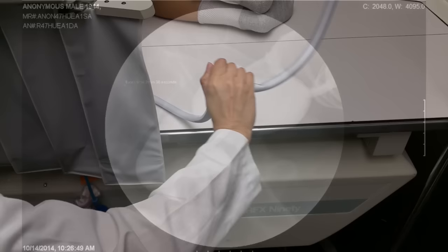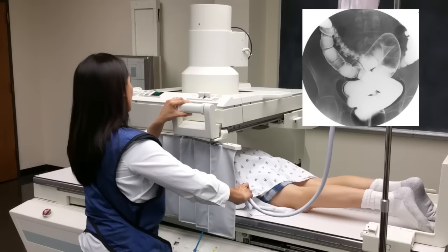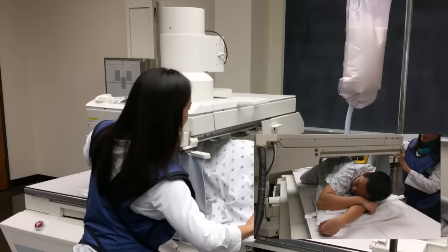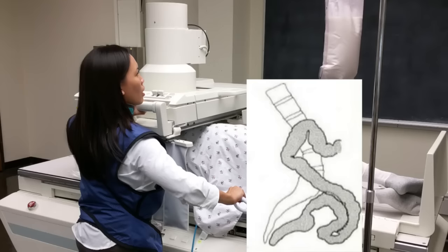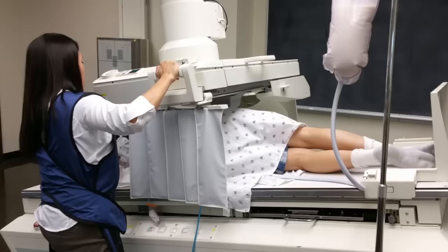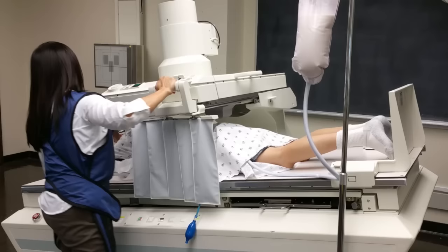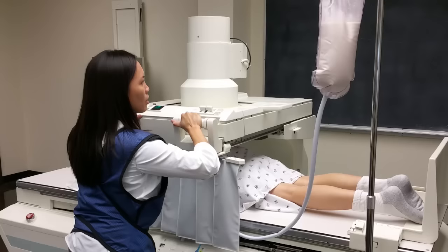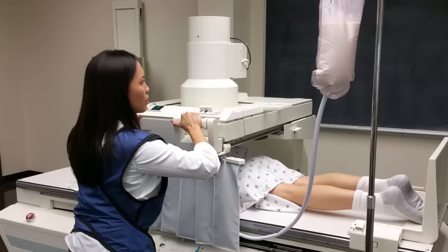The tube is only opened partially because a rapid distension of the rectum will increase the patient's urge to defecate. My foot intermittently depresses the pedal to watch the flow of barium. In the filling phase, barium should be intermittently watched until it reaches the mid-transverse colon. Turning the patient to the left anterior oblique or left side down position moves barium into the proximal sigmoid colon, the descending colon, and the splenic flexure. You can place the patient in a slight Trendelenburg position if the barium isn't moving into this area. Use fluoroscopy intermittently and briefly during this filling phase, but carefully analyze the contour of the colon and look for any abnormalities or defects in the barium pool.